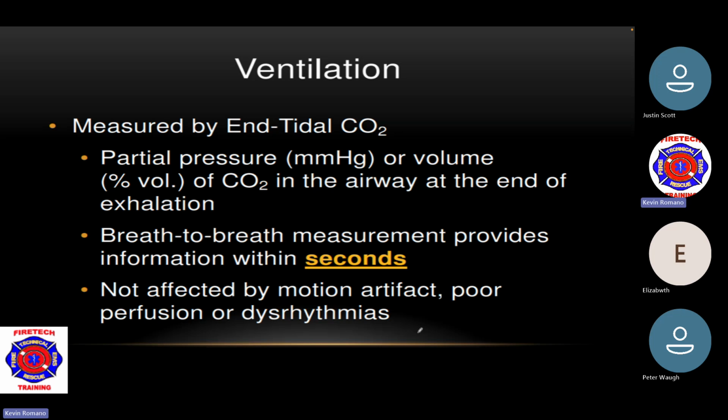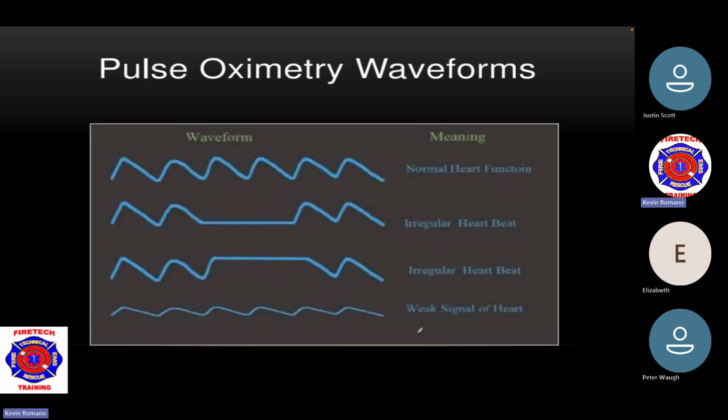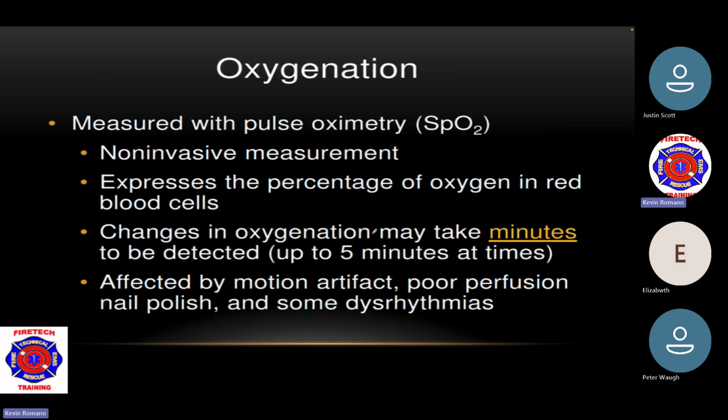We're still going to get a reading. Whether it's a good reading or a bad reading, if they're acidotic or alkalotic, does not matter. We're going to get a reading. It's going to give us something, and it's going to be accurate. Now, we mentioned before in the previous slide, I'm going to go back here. Look at this number here. Let's circle that for you.